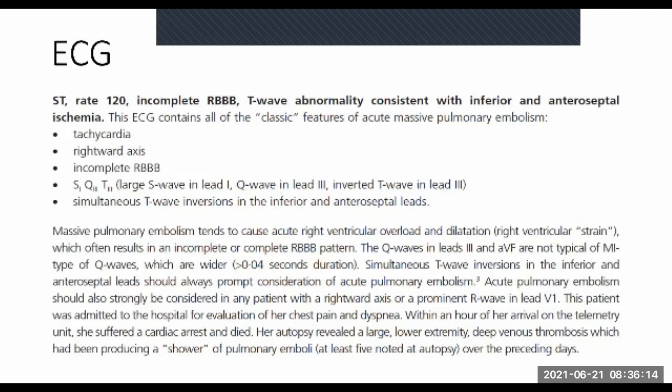So this is the type of patient that, if you go back to the ultrasound lectures, besides looking for pulmonary embolus on ECG, we would then look at our flow in the deep veins of the leg. We'd then also do an echo to have a look as well. We'd look for things like McConnell's sign, right ventricular strain, right ventricular enlargement, right atrial enlargement, all the typical things that we had seen before.